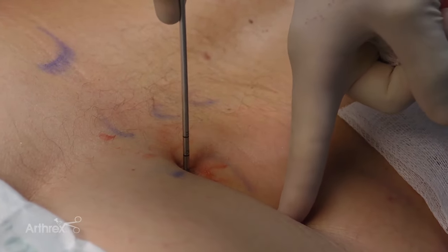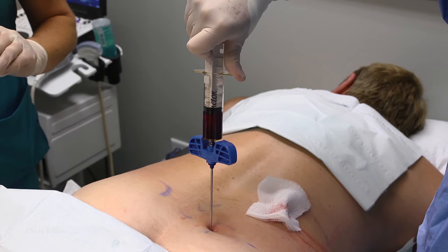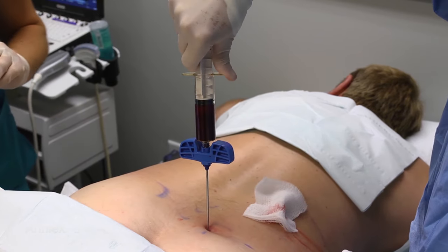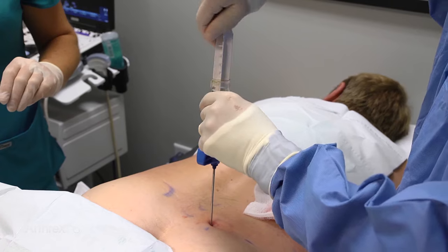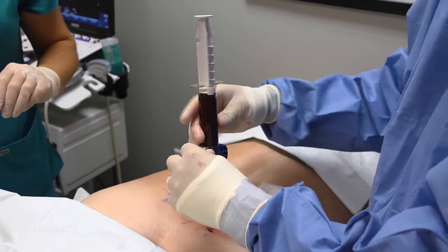We'll just keep going around and around in a circle, getting a milliliter or two cc's each time, turning the needle 90 degrees, going three times around, pulling back about a half centimeter, and repeating. We've got our first one done.